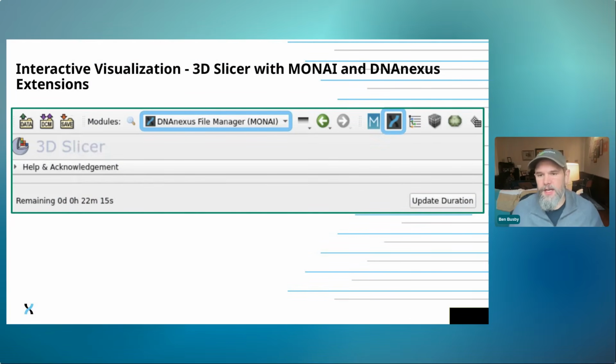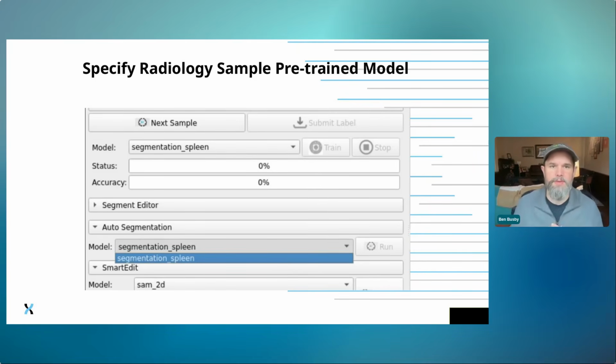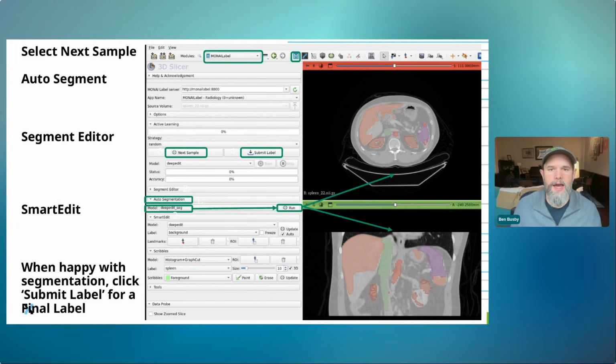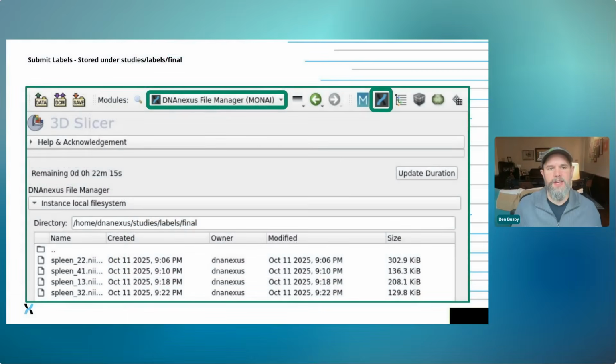It's really nice that there are interactive visualizations in 3D Slicer. That's something that I'm very happy that DNAnexus has made available on the RAP in really compartmentalized apps at this point. And these slides just walk through how to think about doing that kind of thing and implementing annotations in a model.